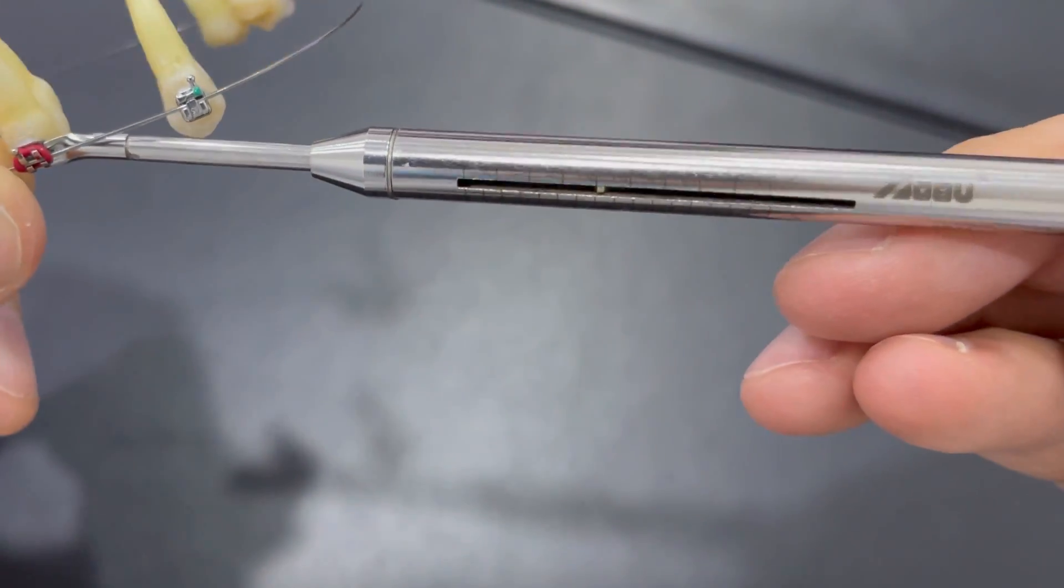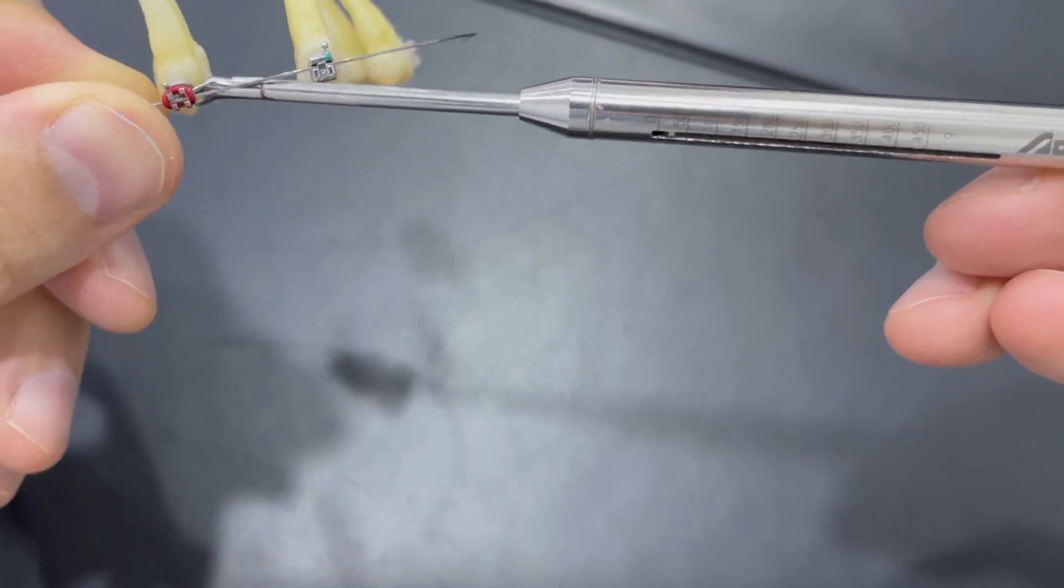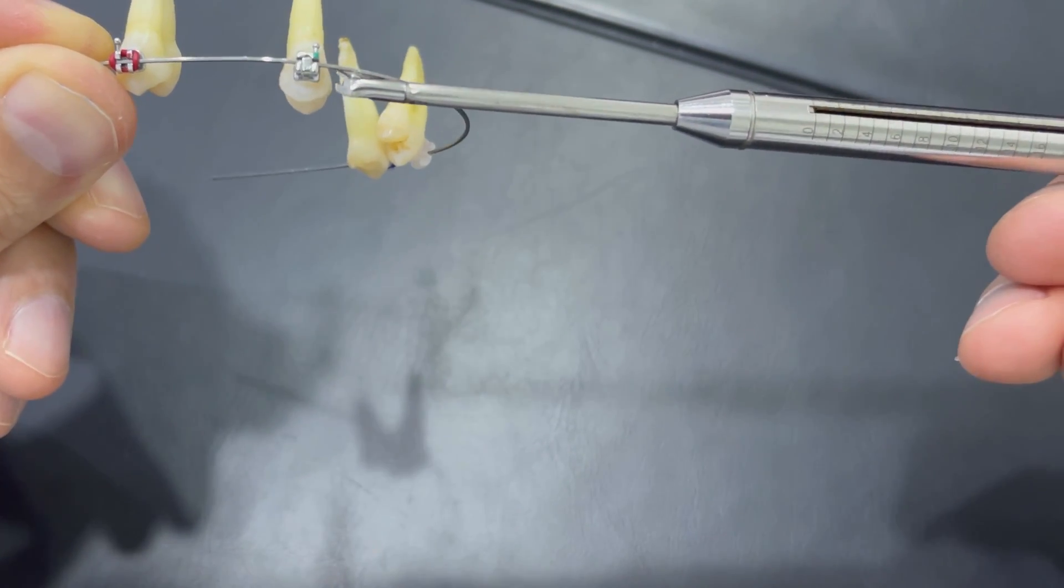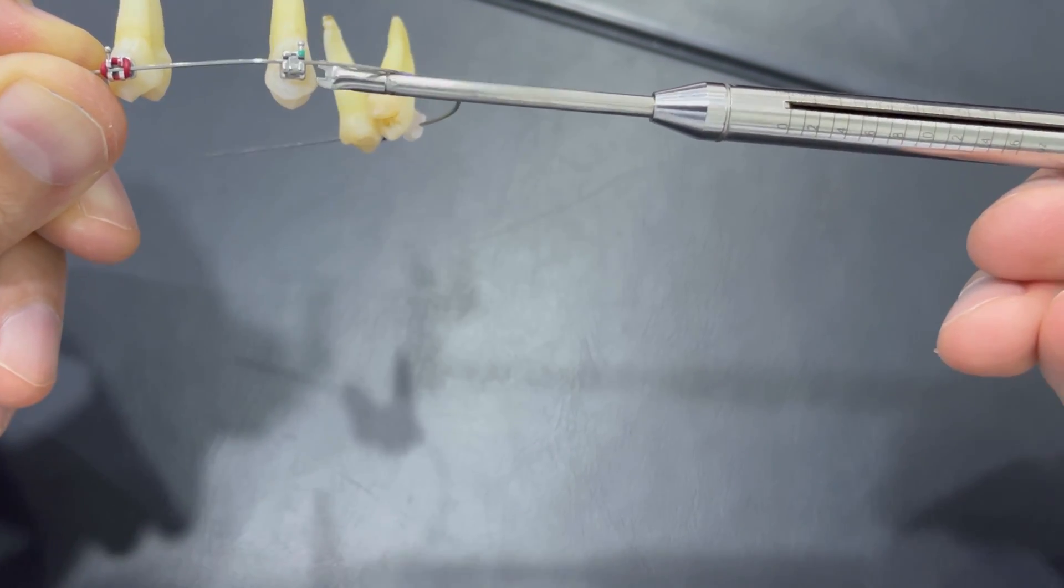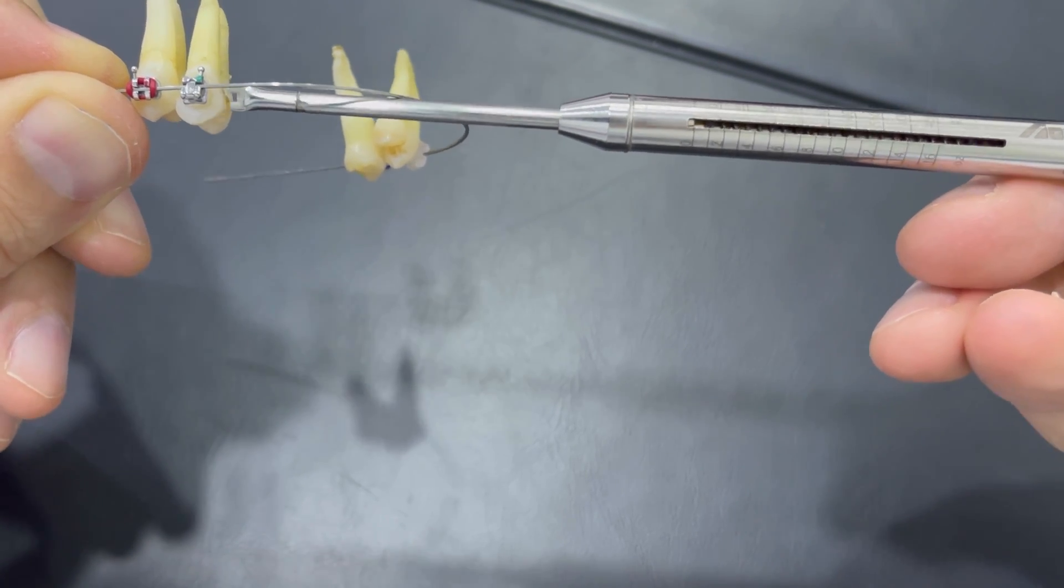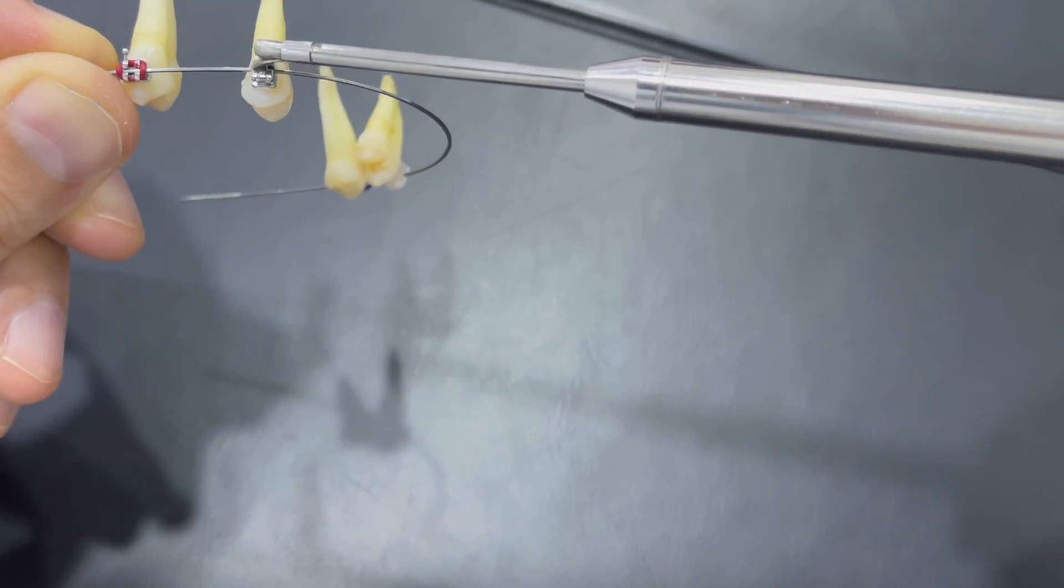300 grams to move the normal ligating braces with the rubber band, while the self-ligating braces require almost 5 to 10 grams.